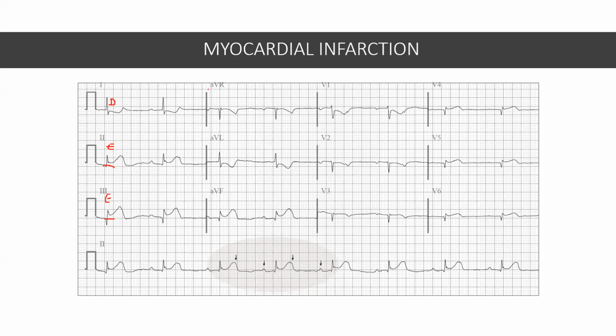In 12-lead ECG, for the diagnosis of STEMI, we never look at aVR. aVR is only useful for us in certain situations, such as in diagnosing dextrocardia, or perhaps pericarditis. But in the diagnosis of STEMI, which is our topic for today, we do not look at aVR. So let's skip aVR, and now we're going to go to aVL. What is the situation of our ST as far as aVL is concerned?